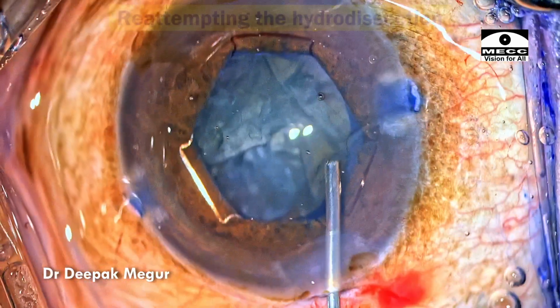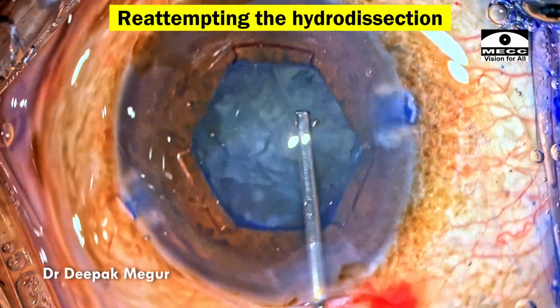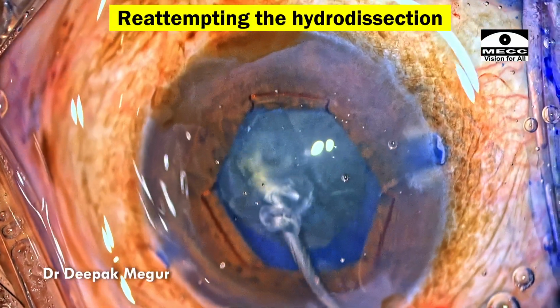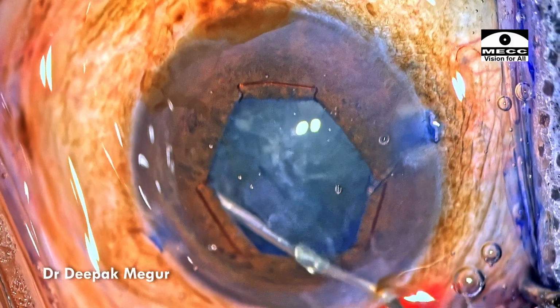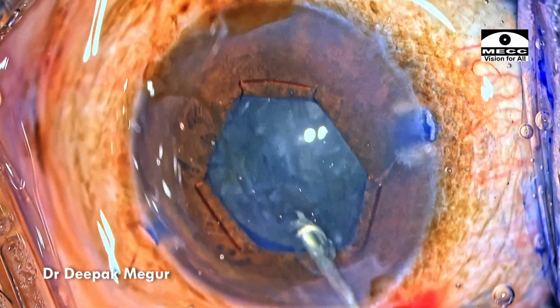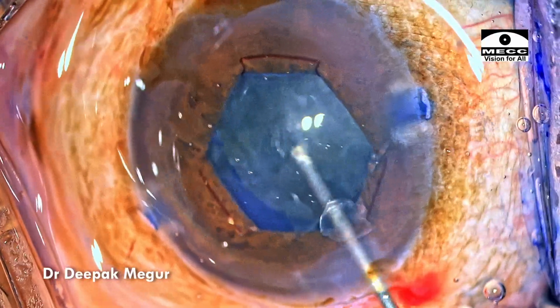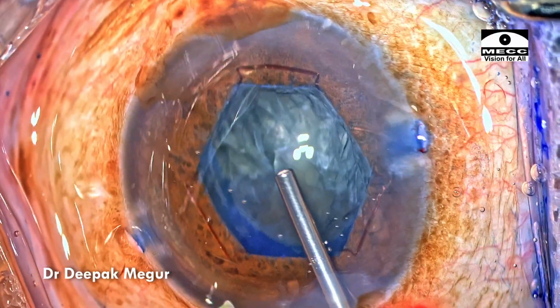Now, with the capsular bag being well supported and stretched because of the CTR, I go ahead and repeat the hydrodissection, and the hydrodissection is much more effective now with the bag being in a stretched position. With the cannula itself, I nudge the nucleus down to see that it is free from its attachment to the bag. I proceed to emulsify the nucleus.